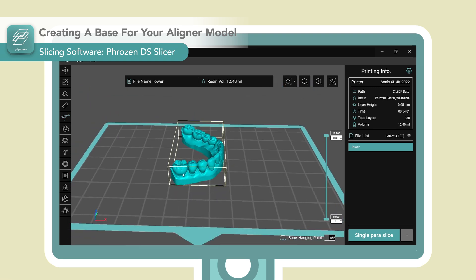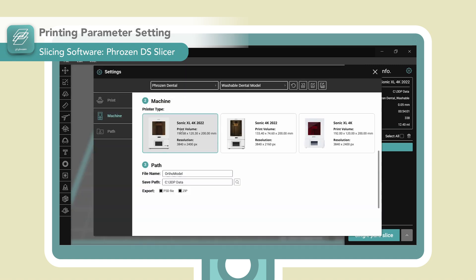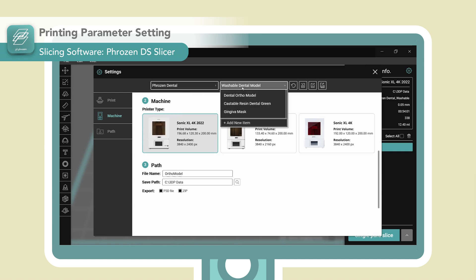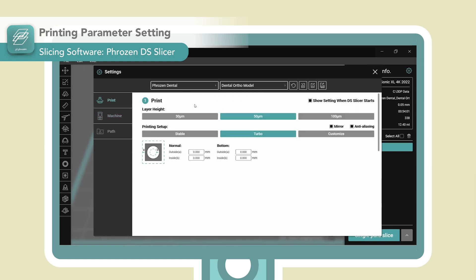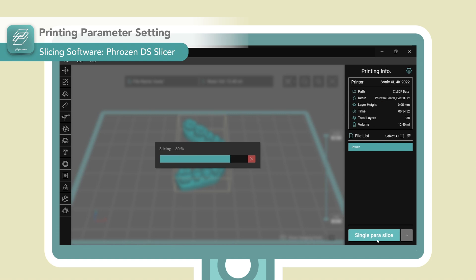With the base sorted, we can move on to the resin profile settings. Each printer and resin have different resin profiles, and choosing the proper setting is crucial for a successful and accurate print. This slicer provides pre-validated settings for all compatible resins on FrozenDental printers — you only need to select your printer and resin, and you'll have a ready-to-print file with the correct settings.